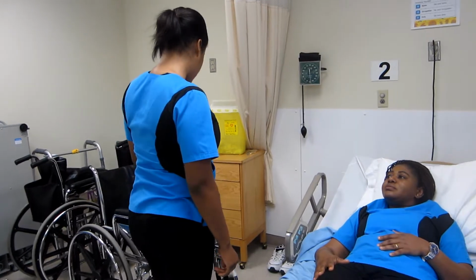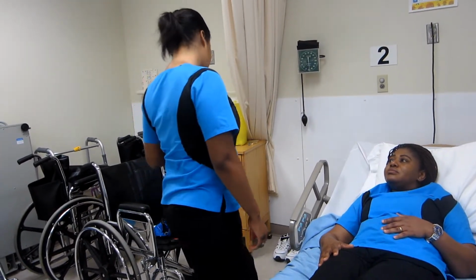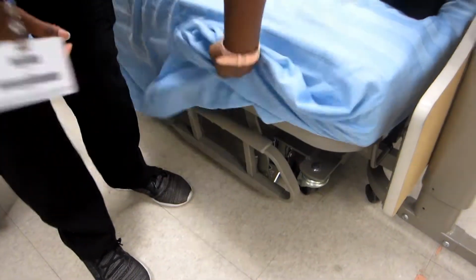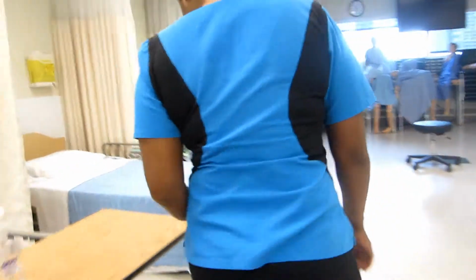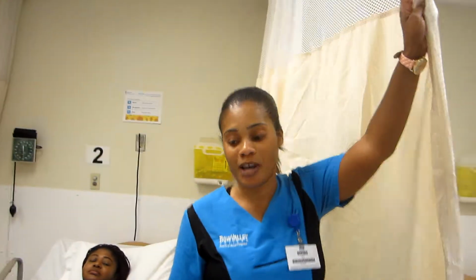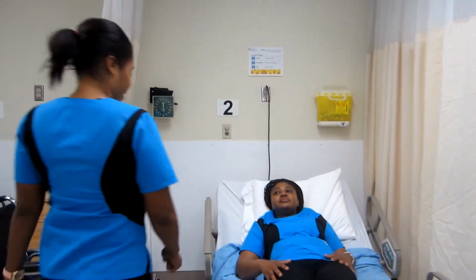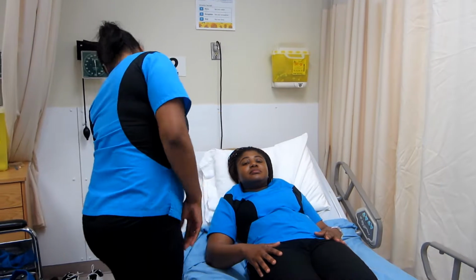So I'm gonna be transferring you to physio, and I'm just gonna make sure that your bed is safe and locked. Okay, and it is indeed locked. While we're here, I'm just gonna provide you with some privacy. All right. So I'm just gonna raise the head of your bed a little bit so it's easier for you to move.